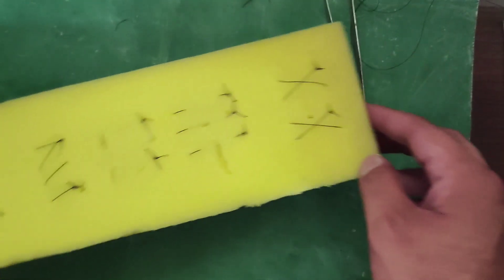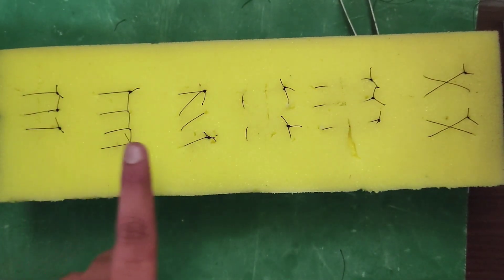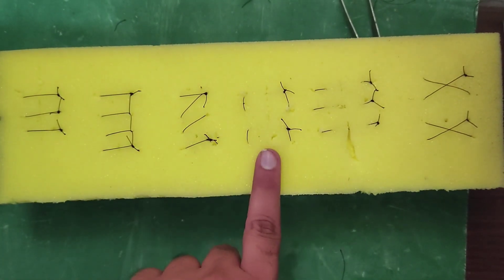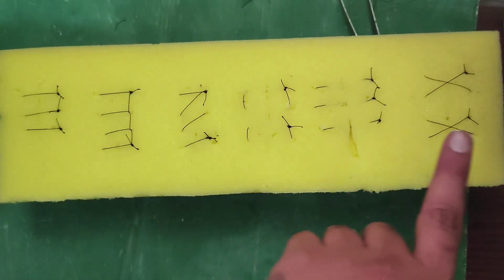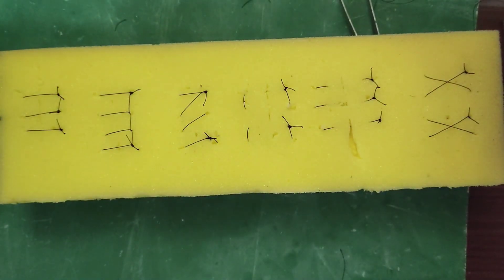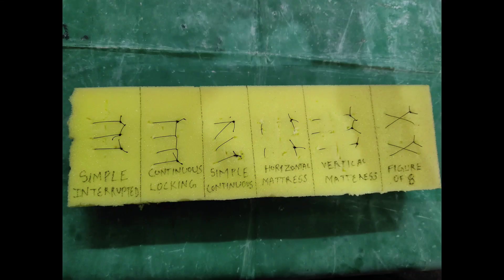So my sutures are ready — are you? If yes, go grab your instruments and start practicing. Not on a patient — on a suture board.